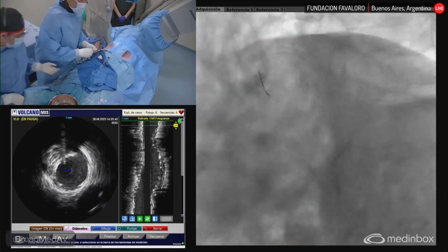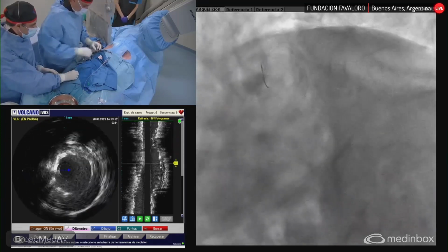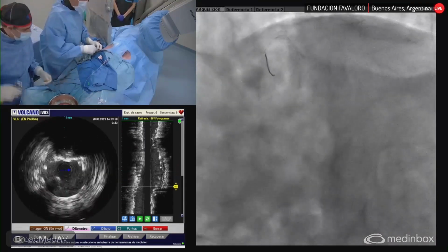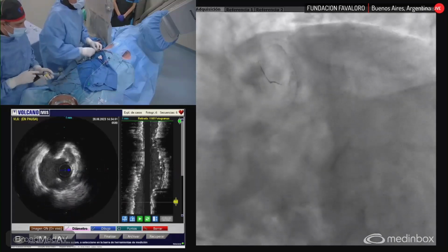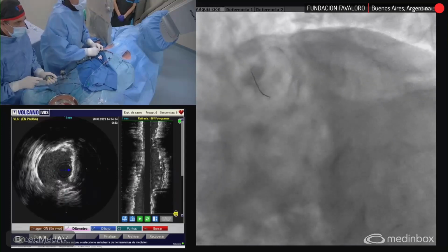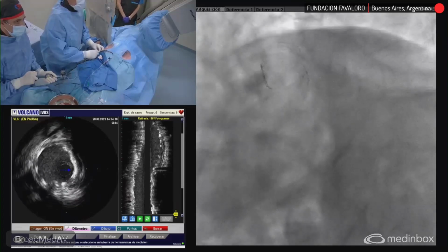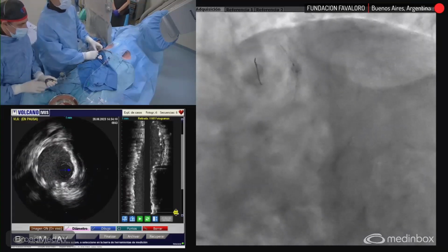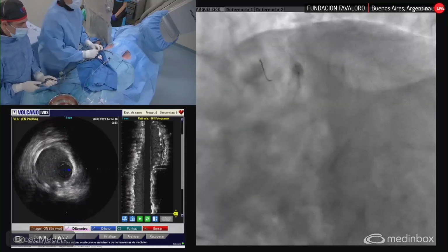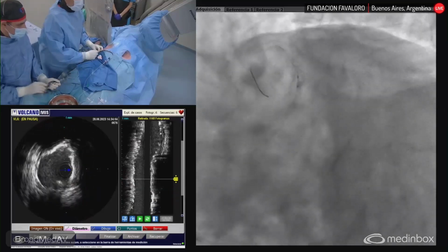You can see now. The problem is there is the tortuosity, Gustavo. Yes. So this is what I scare a little bit to overstretch there, because we have a rectification, we have the calcium and so on. You're right. And the risk of perforation also. Yeah, a little under expansion there. 1, 2, 3, 4, 5, 6, 7, 8, 9, 10, 11, 12. Okay, deflate. 14, 16, 18.